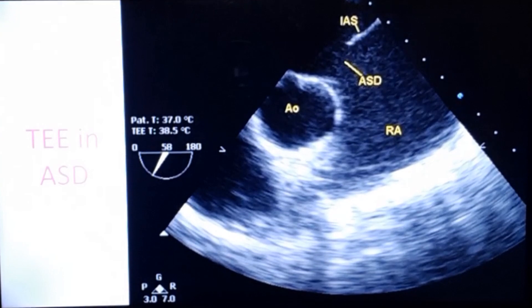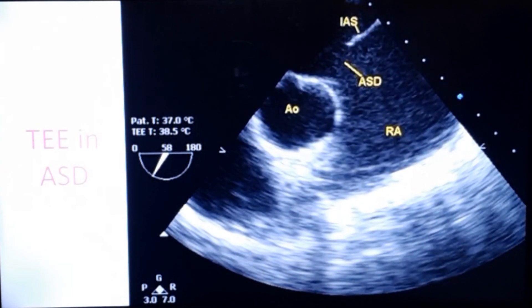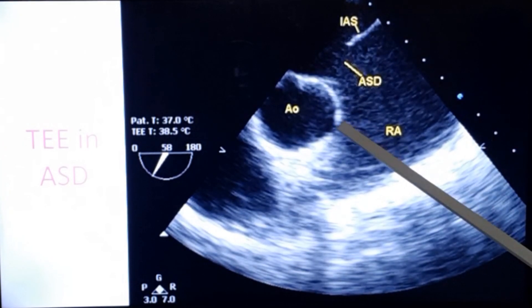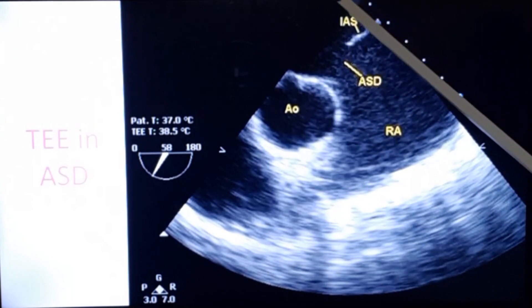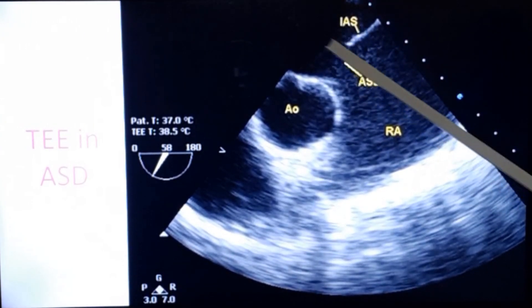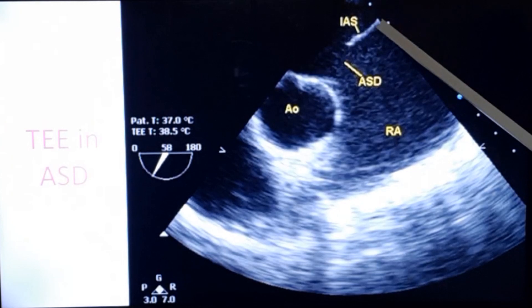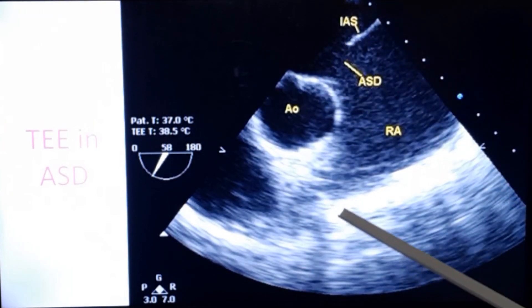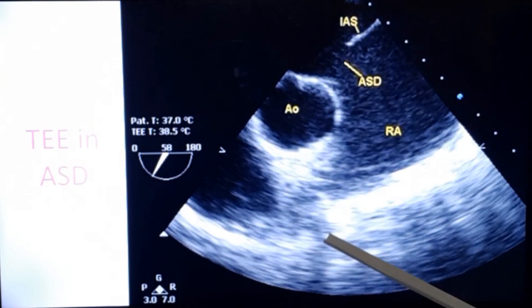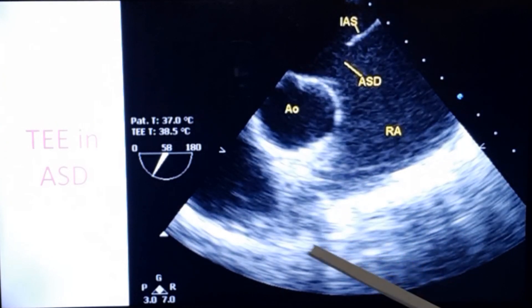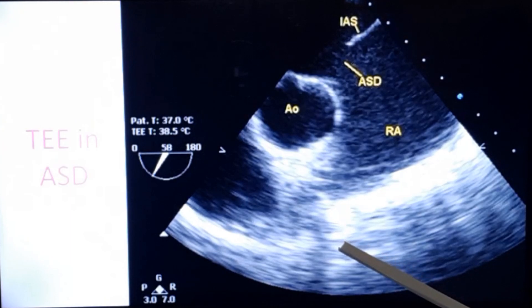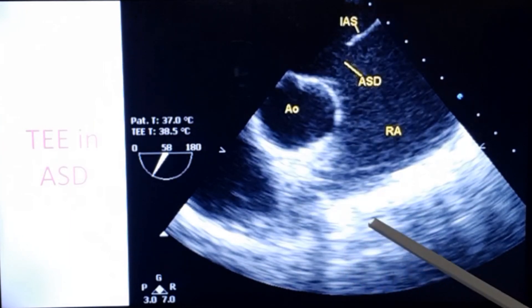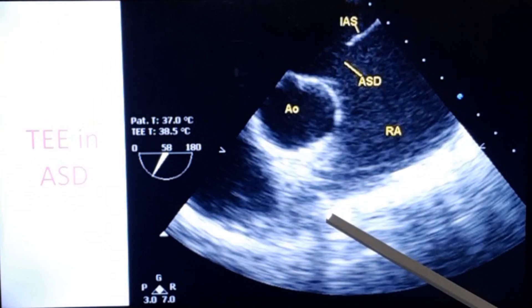Evaluation of atrial septal defect, especially the rims, is better done by transesophageal echocardiography. The transducer is placed in the esophagus just behind the left atrium. This is the right atrium and inter-atrial septum — the defect is seen very well. The advantage of transesophageal echo is that in adults, when transthoracic echo is done, sometimes if the echo window is not good, the inter-atrial septum may not be imaged well.